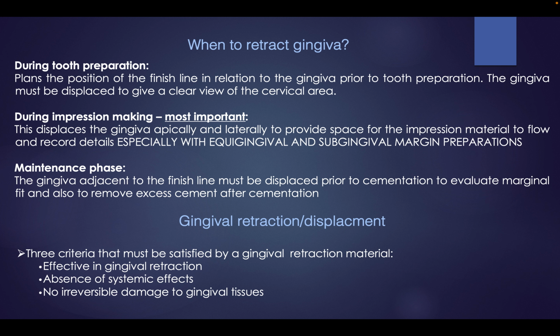So when do we retract the gingiva? During teeth preparation, it makes your life much easier to move the gingiva away to have a drier area and to have a better view and contrast. As we said, during the impression making, it's the most important time when you need to retract the gingiva.